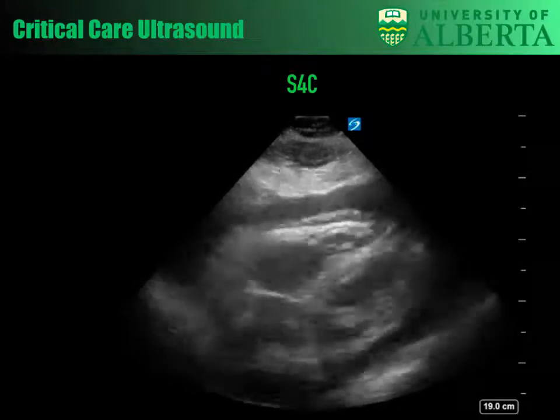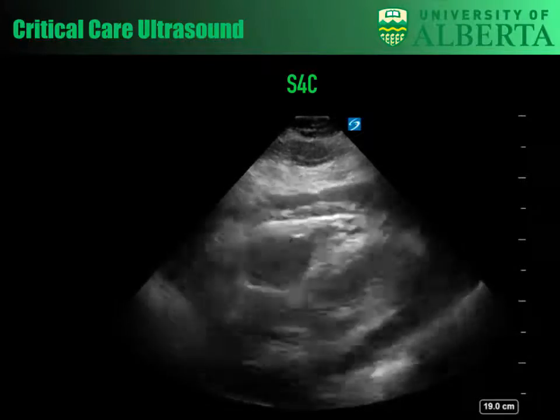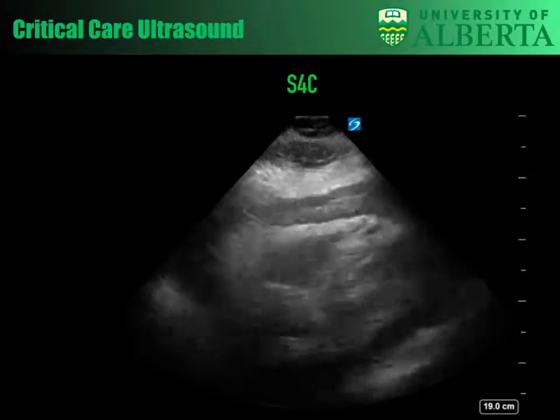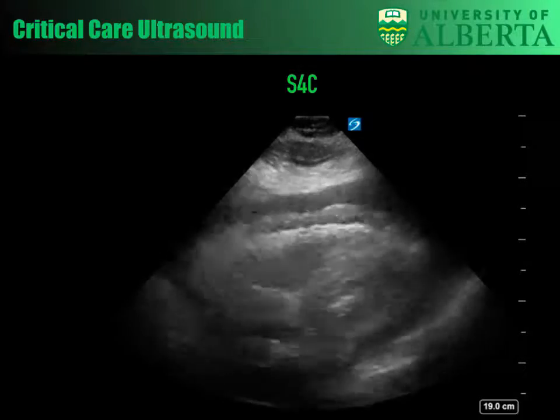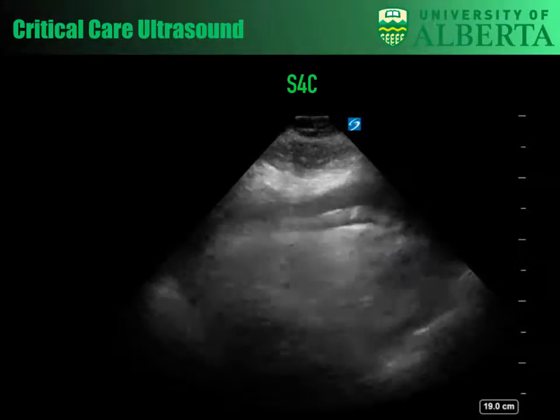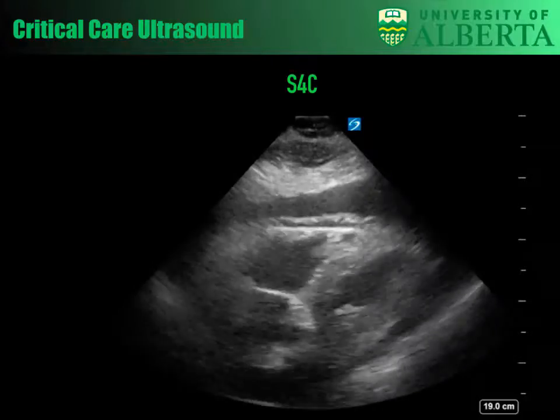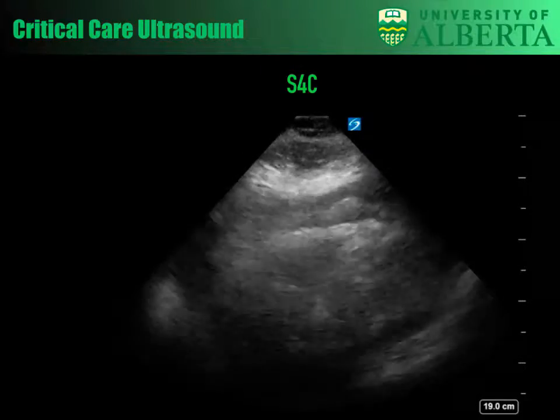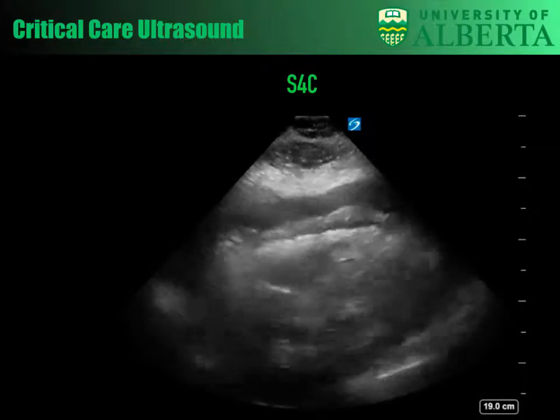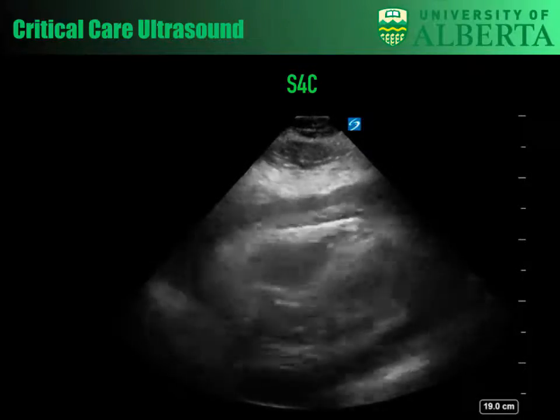Now, keep in mind, this was post 6 liters of fluid, and at this point in time, she was actually weaning down a bit on her norepi. But what do you guys see here? Maybe a pretty large pericardial effusion. Yeah, it's a pretty large, obvious effusion, right? And looking at the axis, if that's a 4-chamber axis, then it's really compressed throughout. It's so hard to tell because everything is collapsed.